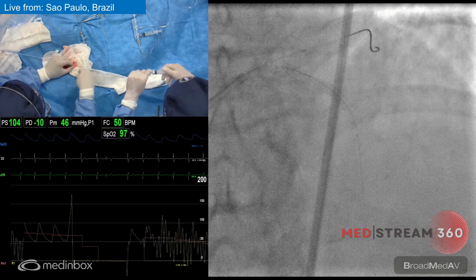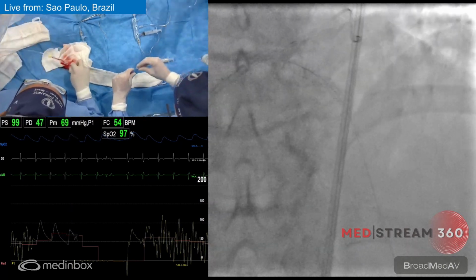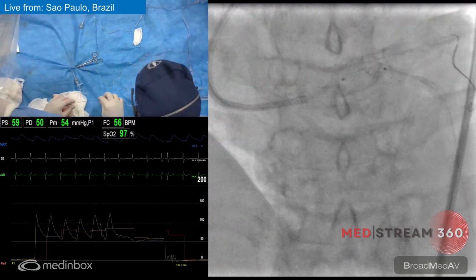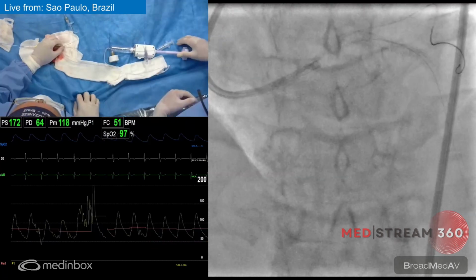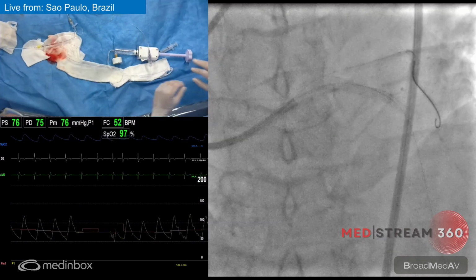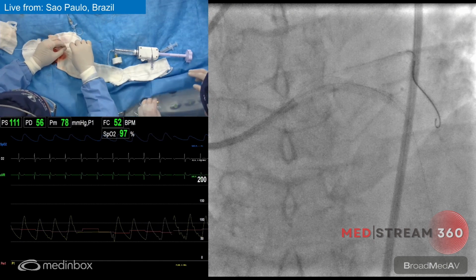And I think it's good to have a larger stent now, right? In the proximal segment. One stent only might make things a little bit harder. So you can first pull a little bit, and then you can go to the larger balloon. Okay. The takeoff of the circumflex, yeah. Very important, right, Rodolfo? The manipulation of the guiding catheter, to be very careful. Okay, no, it's beautiful, beautiful, beautiful, perfect positioning.